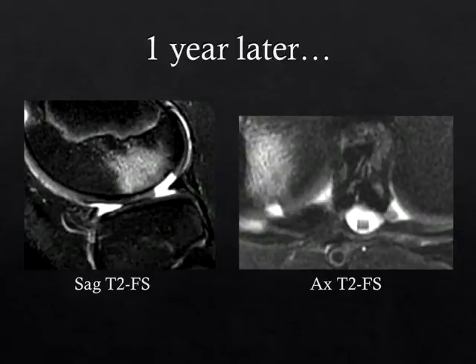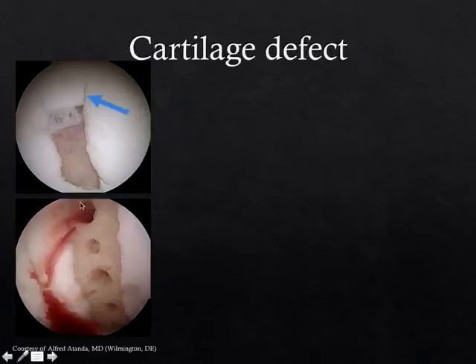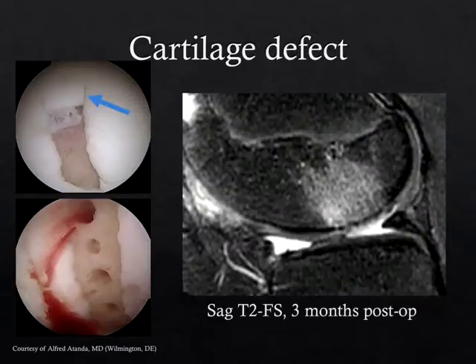So a lot of these kids end up in the future developing cartilage defects and early osteoarthritis. So in order to attempt to restore some uniformity to the articular surface, they do arthroscopy, they go in, they evaluate the lesion. So there's that huge defect. You can see there's a delaminating flap superiorly here. So they ended up resecting that. And then they do micro drilling, which basically they drill up into the bone marrow to allow the bone marrow to bleed into the cartilage defect, and that promotes healing and generation of fibrocartilage, hyaline-like cartilage. And then, 3 months post-op, you can see she still had the marrow edema, but the defect was beginning to fill in, at least allowing for uniformity of the articular surface in the hope that her pain would decrease, and she was having decreased pain.